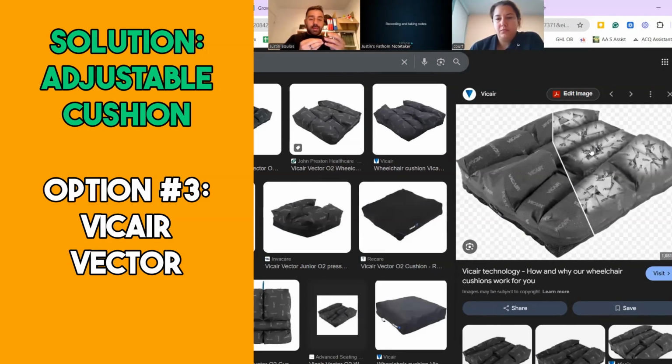So these are all air. I can't remember what the shape is called. Remember the Sunny Boys, back in the day? That's what these are full of, and they pressure map really well, and they also maintain your positioning. You can do some pretty cool stuff with positioning.